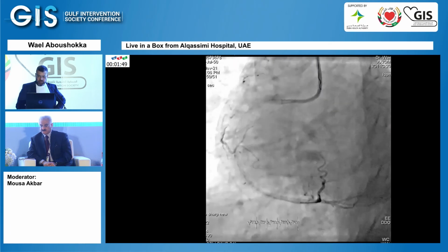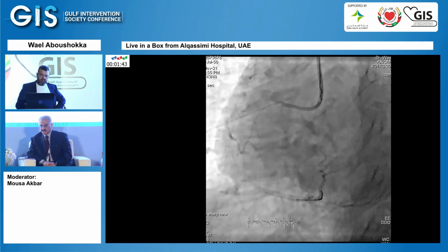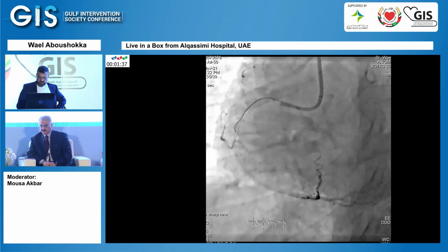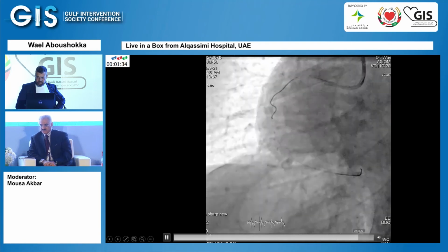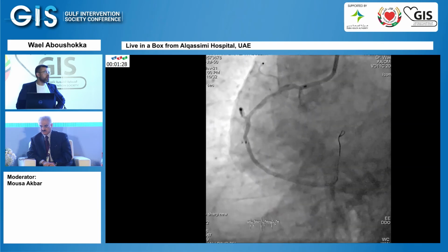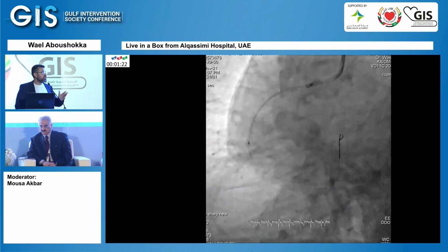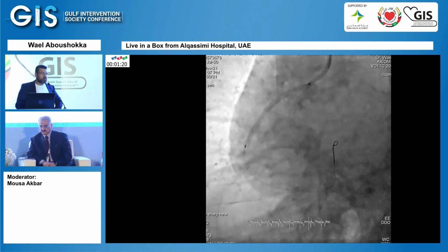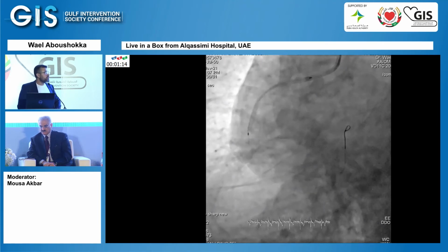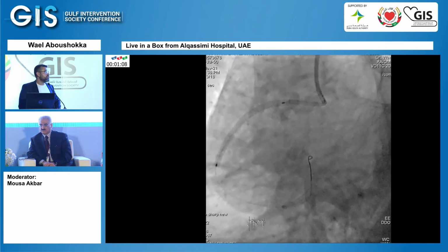So took a 3.0 by 48 stent, fixed the proximal segment up to the ostium. And same as we do with the ostial lesions, you can pull your guiding and then during inflation pull your balloon and flare the ostium. So with the new GRX the control is really very good, and it's in a millimeter by millimeter fashion.